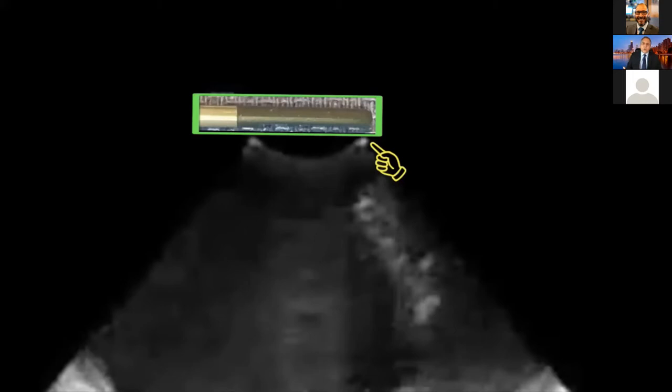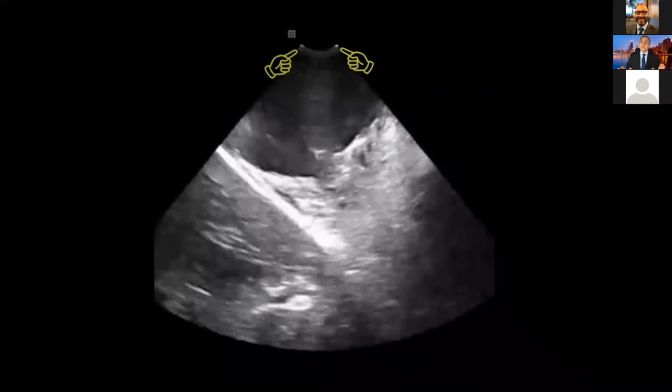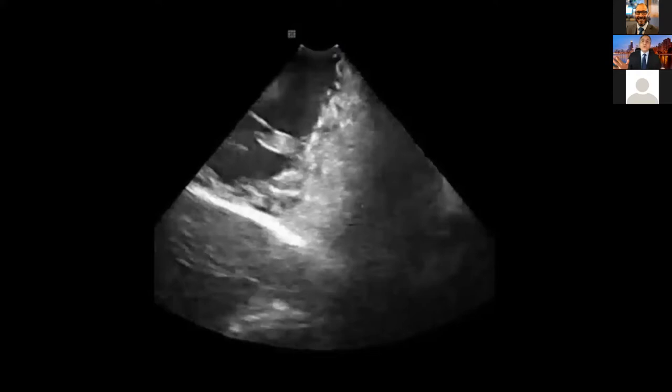My ICE catheter is here in the right atrium because both dots are inside the right atrium. I just went through the tricuspid valve — I passed the tricuspid valve. Now both dots are inside the right ventricle, meaning my ICE is inside the right ventricle. If I advance it a little bit more, I don't see the black echo-free space in front — I see tissue. Be very careful — the tip of the ICE is touching the wall of the right ventricle. If you advance more, you will perforate. You never want to get close to tissue that becomes white.